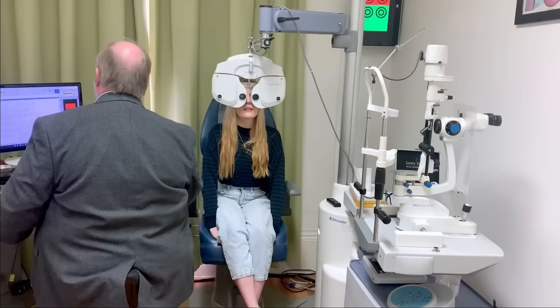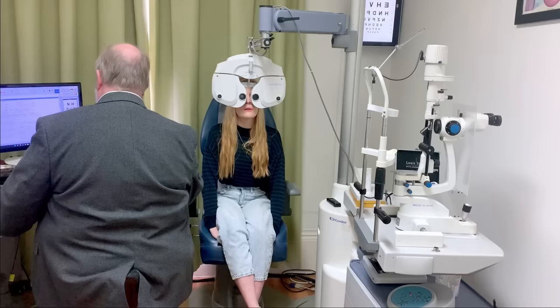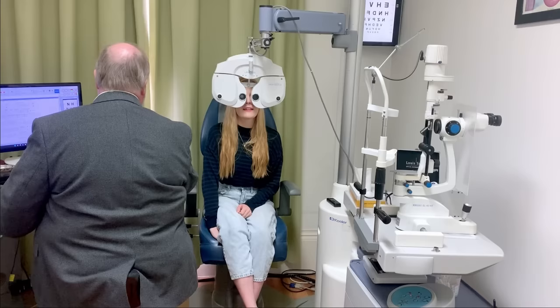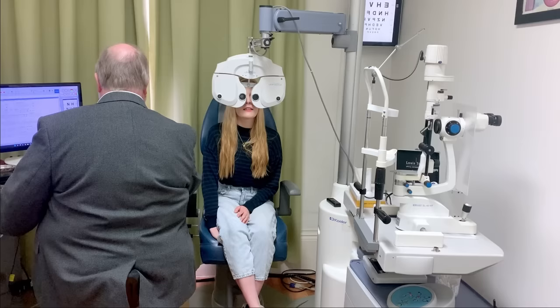And what's the smallest line you can see there for me? I think I can read the bottom. Okay, have a go for me. Oh, okay. I'm starting to doubt myself now. FRDVP. Very good. Now, does it look any clearer with this one? No, the one before. That one's a bit better, yeah, is it? Yeah, it's better. Lovely. And any clearer here? Or better, first one? First one, this one, yeah.